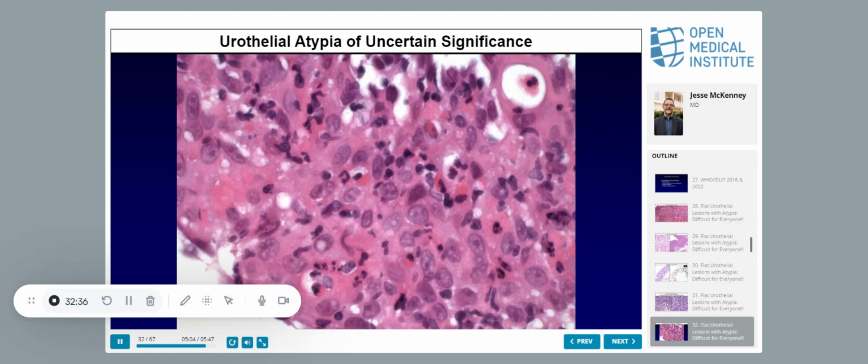If you have a high grade papillary in one container and then a separate biopsy is flat, then you can call it carcinoma in situ. But I'm hesitant if it's in the same container, because it may just be the base of the papillary lesion. As long as you say high grade in one, it doesn't really matter. As long as you give them a high grade that's non-invasive, it's kind of the same thing. People will argue, but if they have CIS, they're higher risk, and it's not going to change the way they manage. That's a lot of hand waving, as we say.